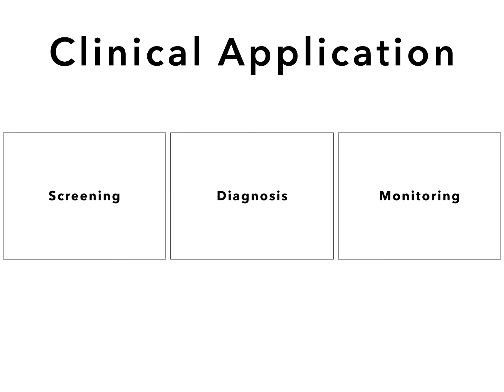At this point in time, I think it's reasonable to use lung ultrasound instead of CT, as it will minimize exposure to other healthcare workers and free up the CT scanner for other patients who actually require urgent CT imaging. However, I believe you also only want to use point-of-care ultrasound if you have a specific clinical question that you need an answer to, or if you have a procedure that you need to perform more safely. Lastly, ultrasound is probably most helpful from a monitoring standpoint, as it can easily be repeated daily.